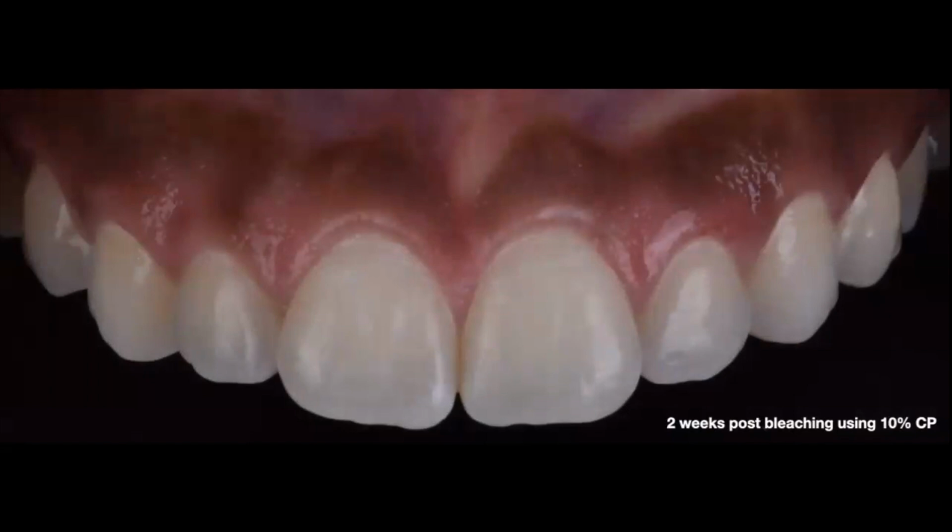We were eliminating all those white spots and just making them much brighter, increasing the value through bleaching. So for this particular case, our protocol was microabrasion followed by bleaching with 10% carbamide peroxide, which is the only bleaching treatment that I normally perform. I don't use any higher concentrations because it's really not needed. 2 weeks later, you can see the results, and the patient was extremely happy.